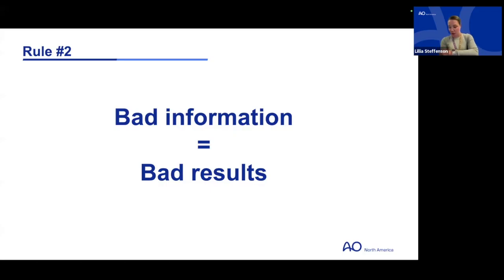It's like, we all learn how to spell the alphabet when we're kids. And if you don't follow the convention of how this letter appears, no one can interpret your writing. So you have to be active in trying to obtain good x-rays, whether that's in the emergency department or especially in the operating room, so that you can interpret what's going on. Yeah, you absolutely need good information to make good decisions.